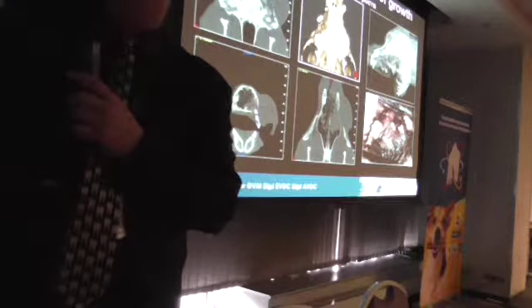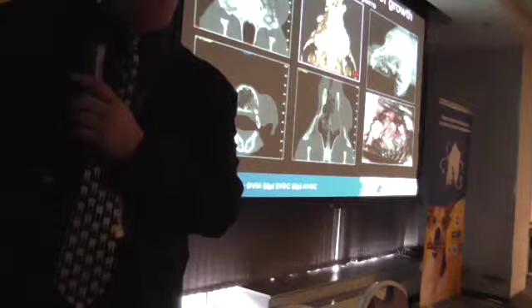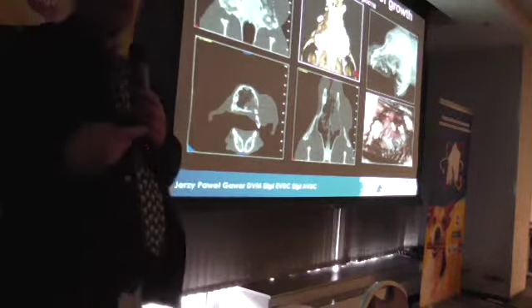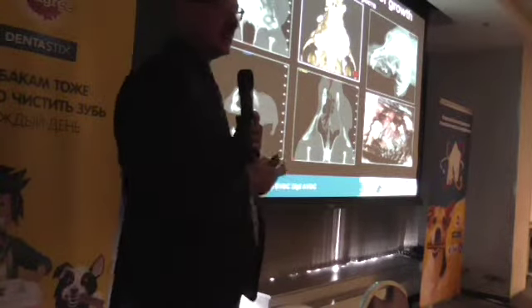So when we see the tumor, oral tumor, on a 2-dimensional full body X-ray, we can see that there is involvement. We really cannot say what is the real extent of a tumor based on the radiograph.